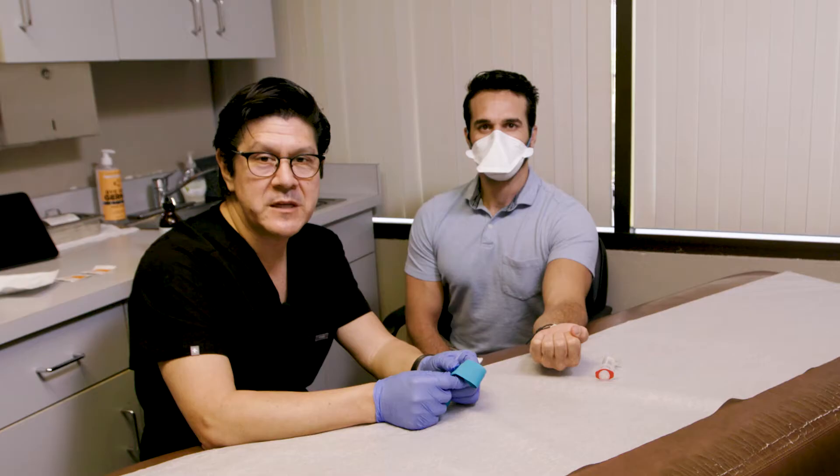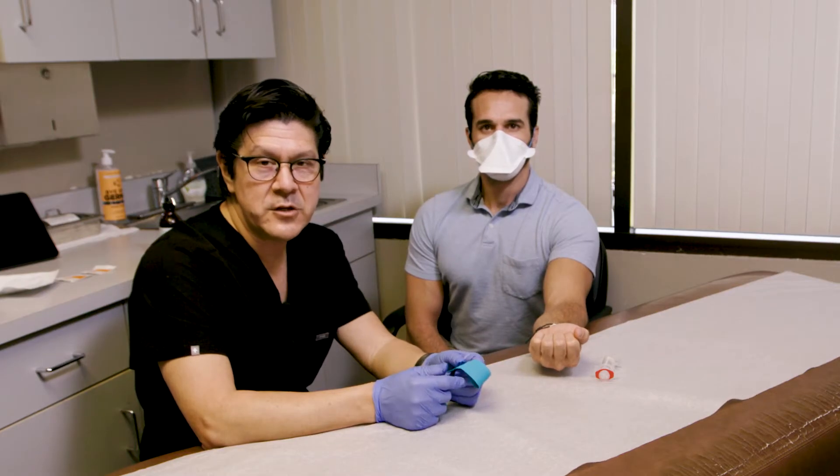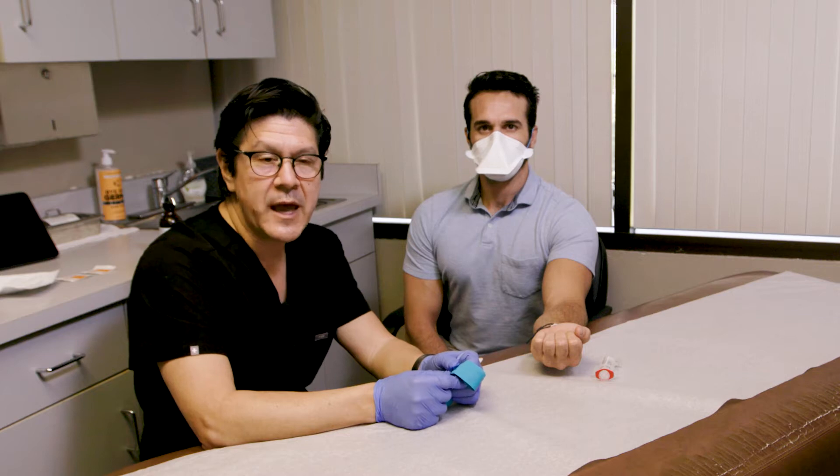The first step is going to be to simply draw the blood. We'll be taking 15cc's of his blood right now, then using the centrifuge to spin it, remove the red cells and white cells, and only have the platelets and growth factors for use as an injection — a leukocyte-poor PRP injection.